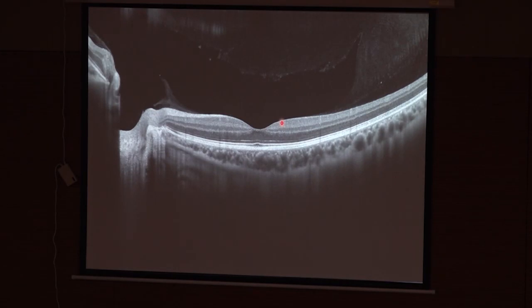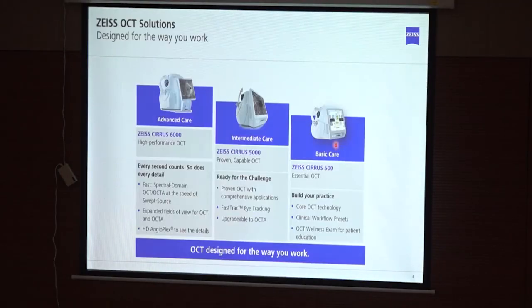So this is an OCT image of a normal patient. Here you can see the fovea, and this is the optic disc area, and this is the choroidal plane, and these are the retinal layers. So we can differentiate the layers on the basis of hyper and hyporeflectivity.